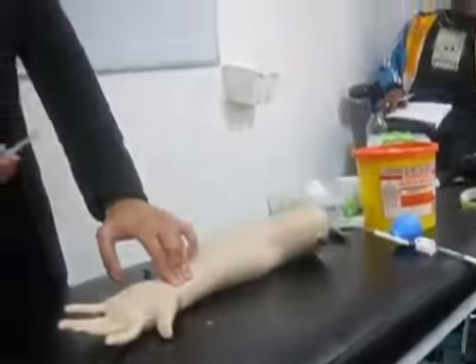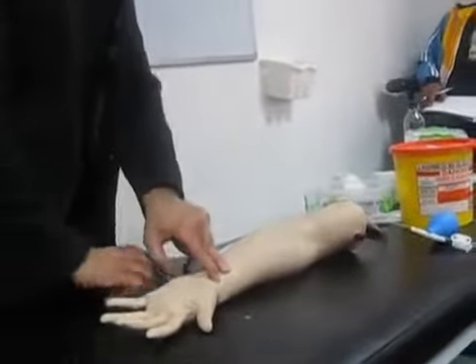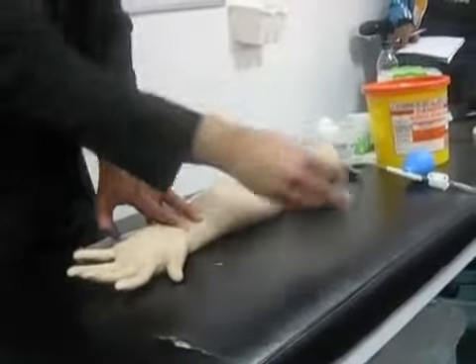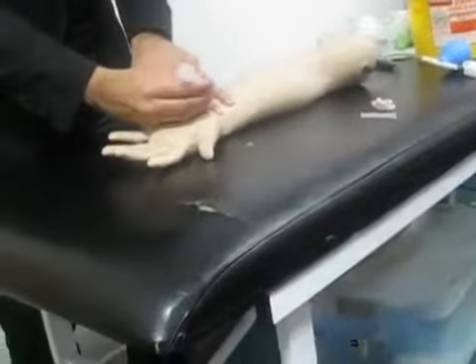May I know where my clinical waste bin is, please? This is your clinical waste bin. Okay, thank you. I'll warn my patient that he'll be feeling a sharp scratch.